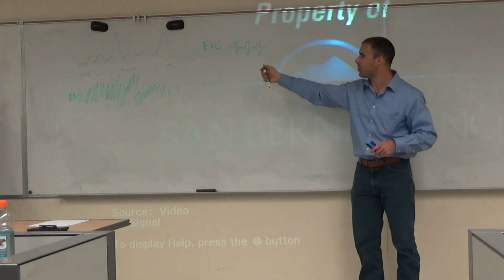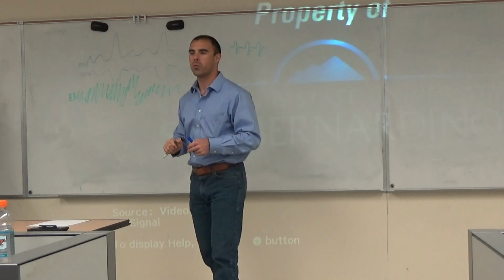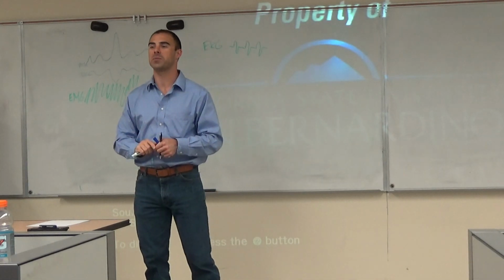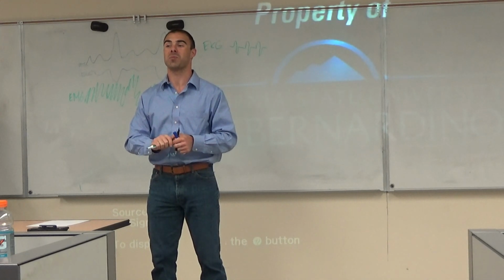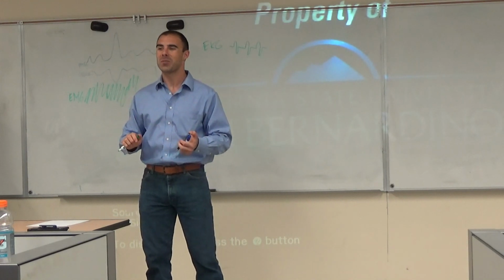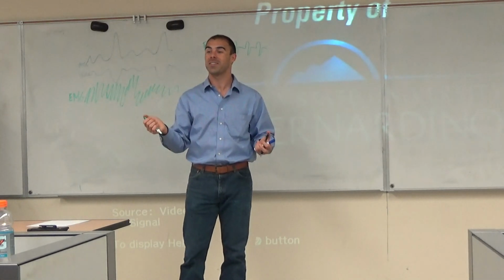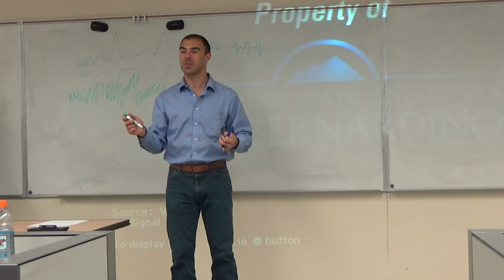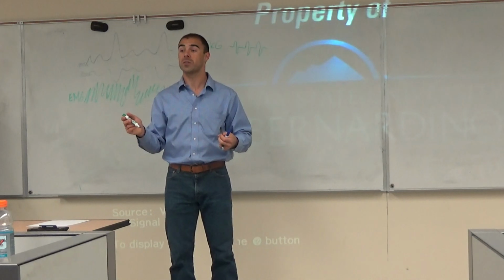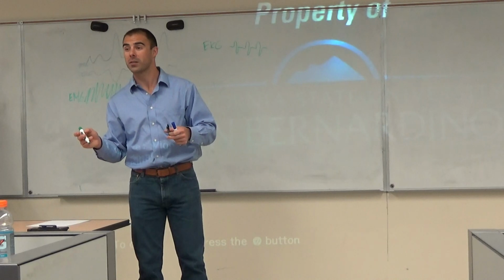Okay, so, George, when we were talking about the VEOG and the VEOG lower, you mentioned another artifact a few minutes ago that would be tapped into particularly by the HEOGs. Remember what you said? Oh, the saccades. Saccades are another artifact that we talked about, right? I know it deals with eyes and where they're fixed, or movement. Like where your eyes go. If your head moves that way, your eyes go that way.